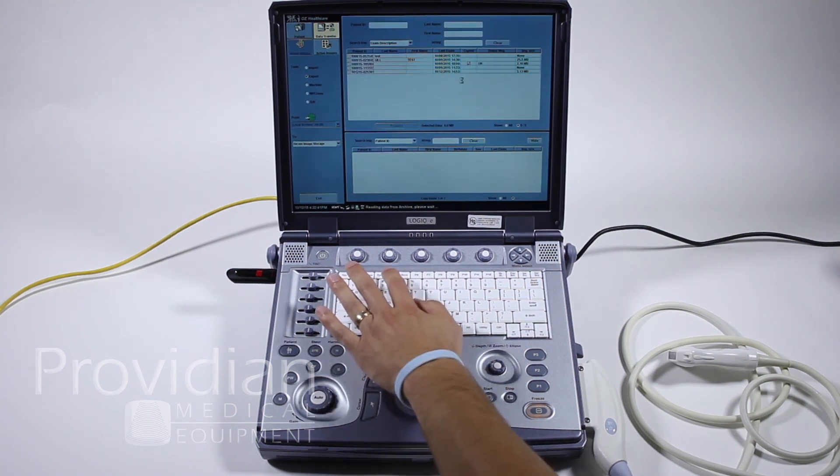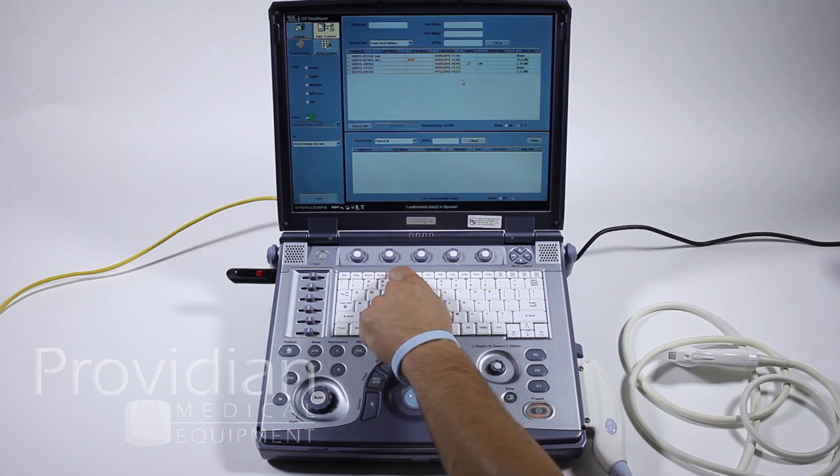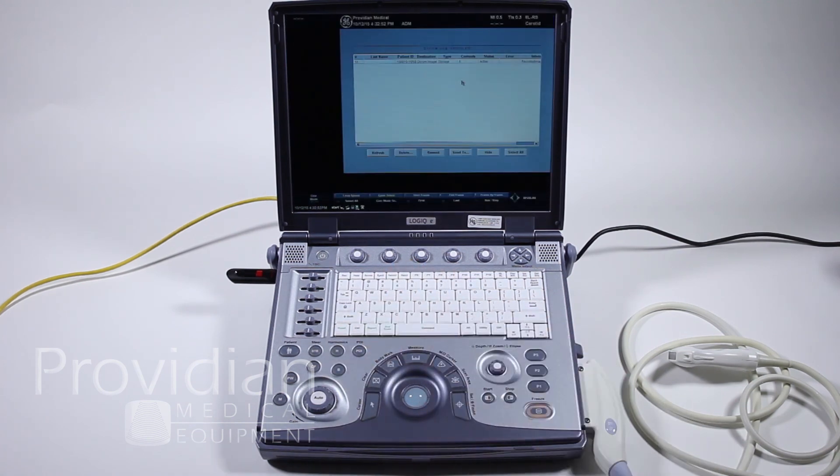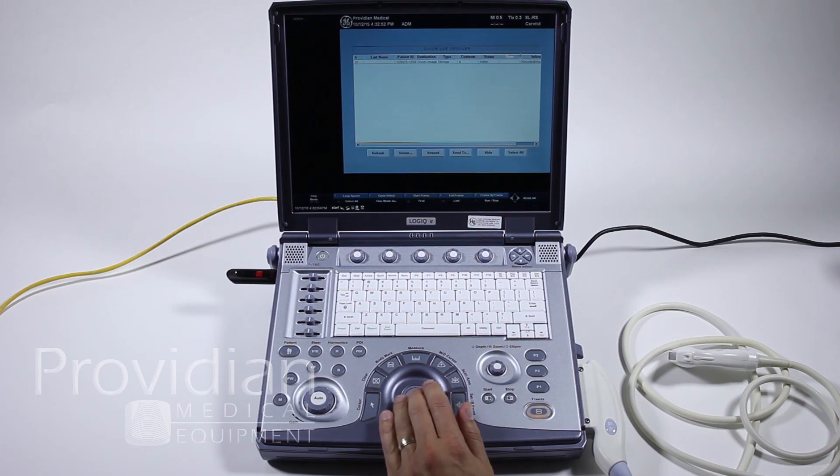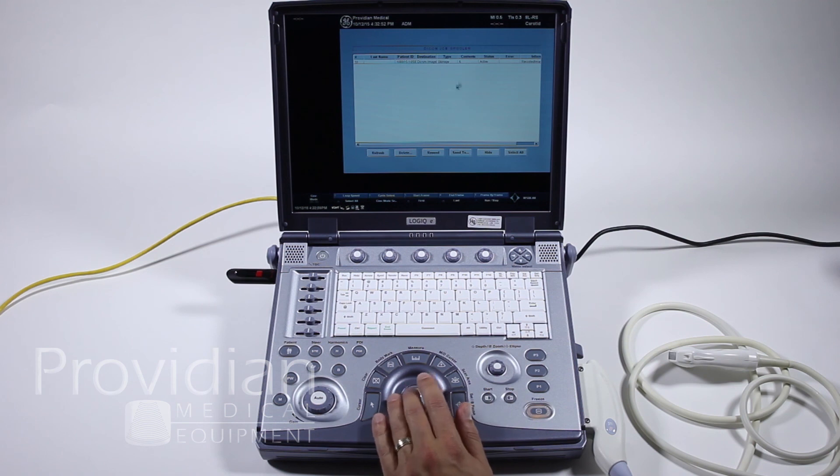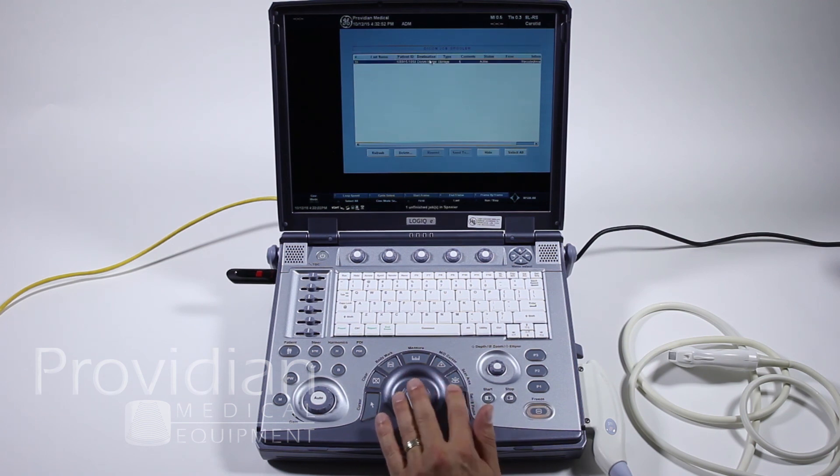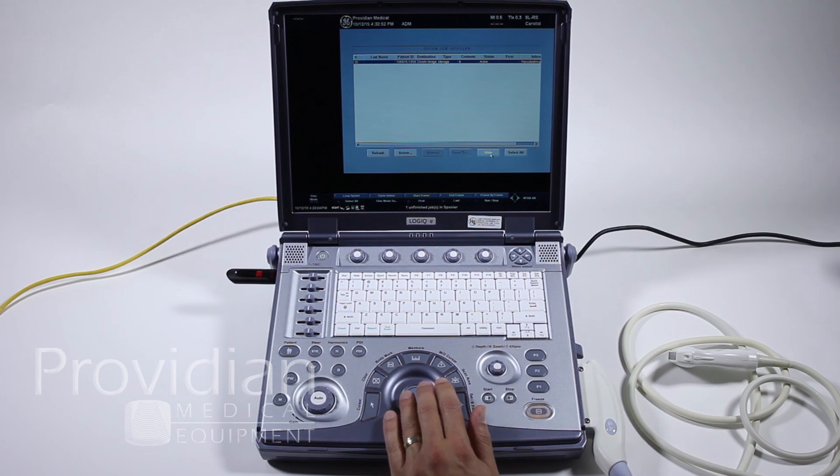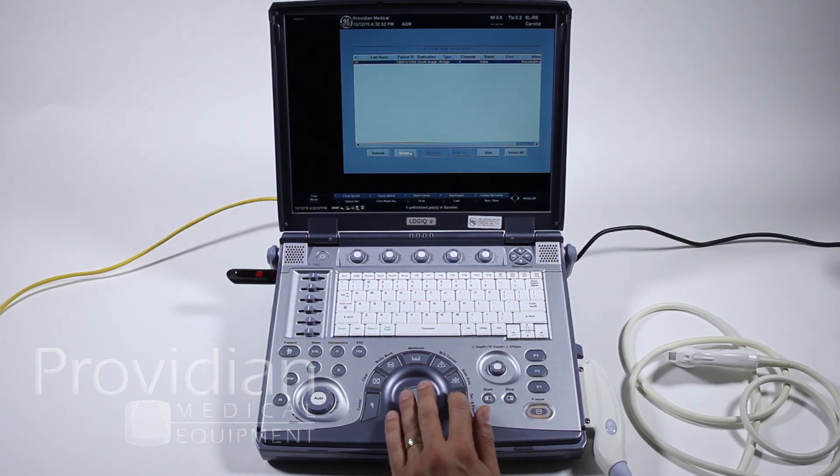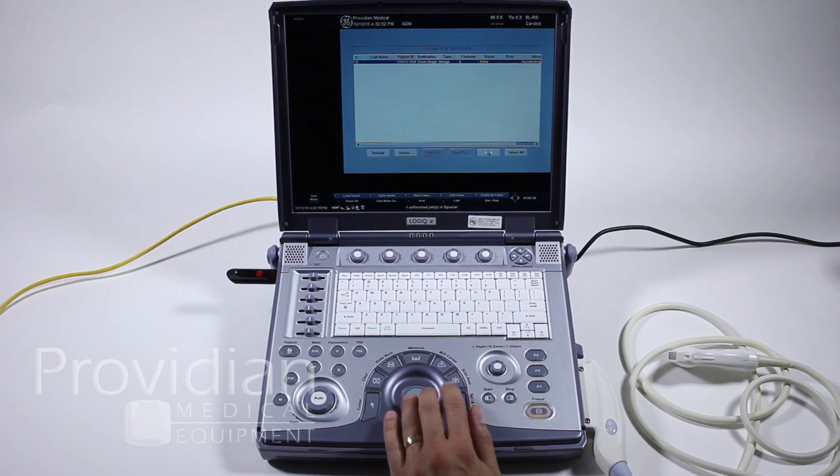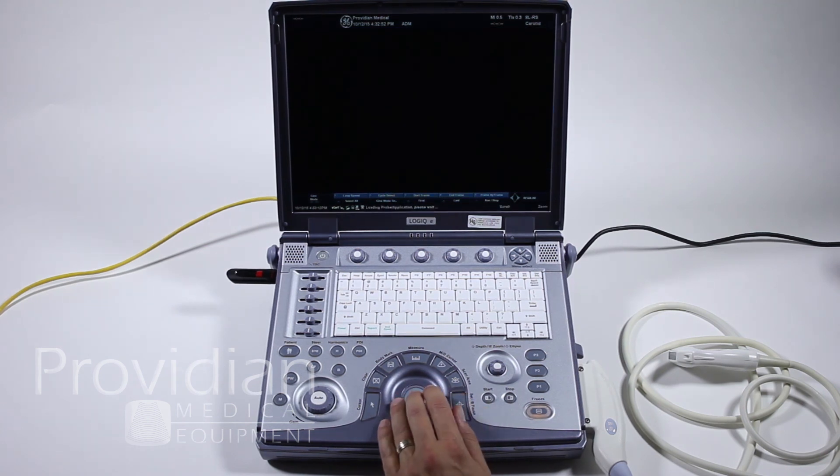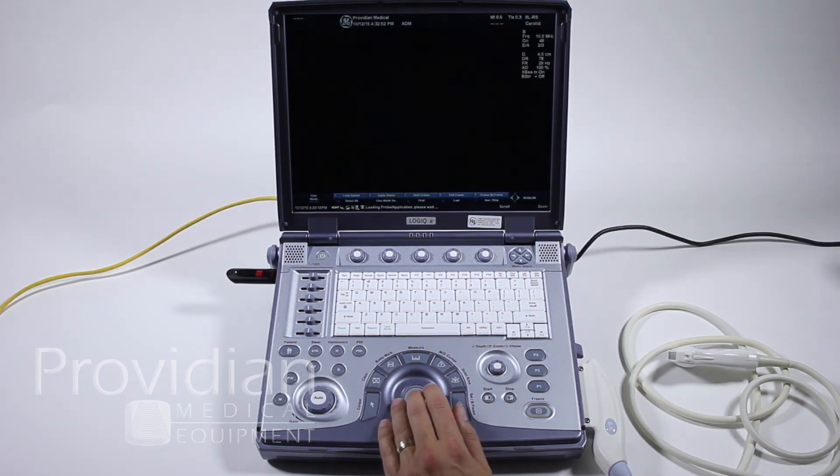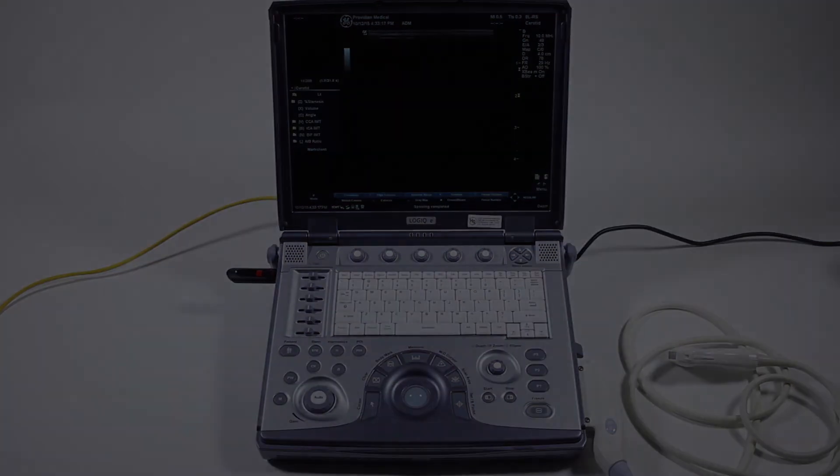Now, I have a spooler up here. This little button says Spooler. It shows my DICOM spooler. I can click on that, and it's going to show everything that I did. Right now, it's saying that there's no error and that it went across the network just fine. I can hide this. I can choose to resend some images to see if they didn't go through. You can delete that as well. If you delete this, it's just deleting this from the spooler. I'm going to go ahead and hit Hide, and I'm back to my imaging screen.